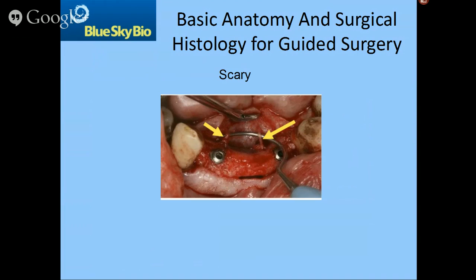Again, this is primarily geared to dental labs, but this is a good review of parameters for dentists who are just beginning their dental implant surgery protocol. Some of the histology and anatomy may be secondary to you, but it's always a good review.